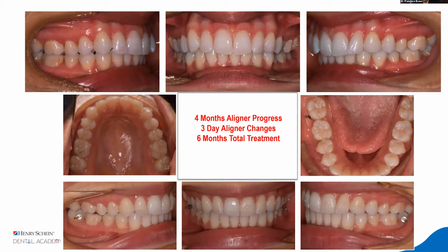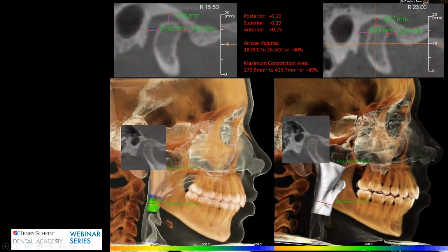okay? In our practices, a lot of people are obsessed with how fast I finish the treatment, and other people with how detailed I do the case, how beautiful I post my picture on social media, or how nice I present these results to the patient. All of the above. However, in the presentations to my patient, I literally demonstrate and quantify how much airway space and how much change you produce in the airway spaces.